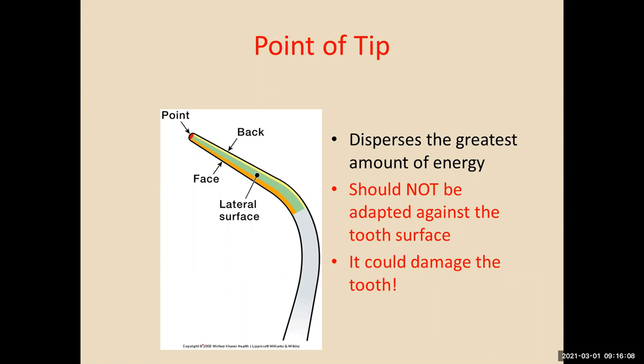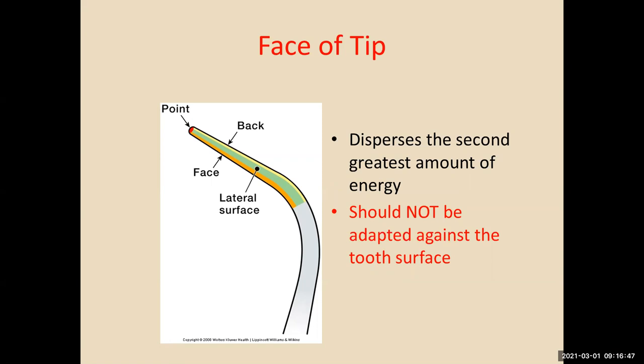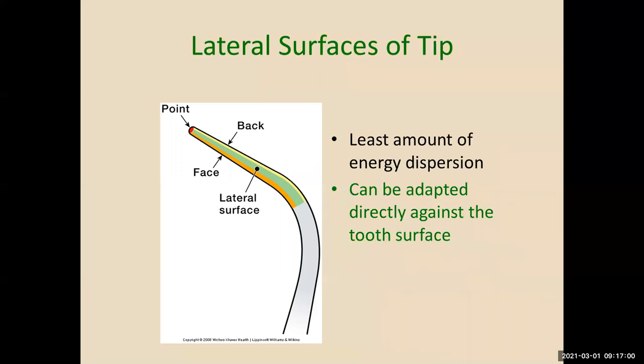The point of the tip should not be adapted against the tooth surface. It could damage the tooth. Now, do we use this point? Yes, we do. If there's a huge ledge of calculus on the mandibular anterior, for example, we're using that tip. It depends on what we're after, but we're not using it on the tooth. We're using it to try and fracture the calculus off. So again, it depends on what you're doing. You want to use the lateral side of the tip against the tooth. The face of the tip, again, you want to be careful. Lateral surfaces have the least amount of energy, but guess what? It's easy to use a lateral surface with the instrument, so you're using it.